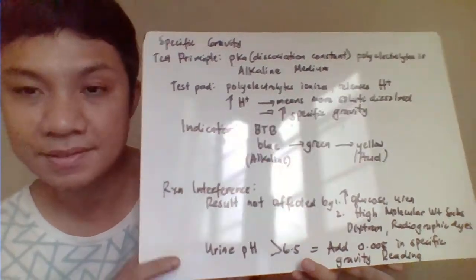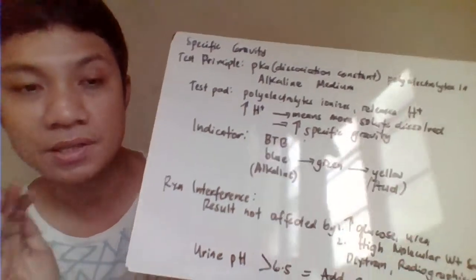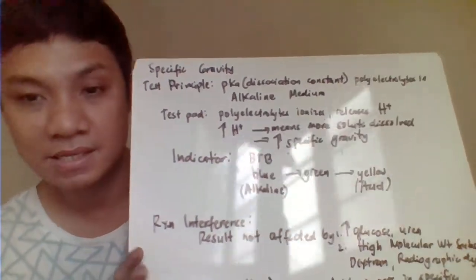Okay, so remember for this topic, you just need to identify the reaction, the test principle, and some interferences. Okay, thank you.